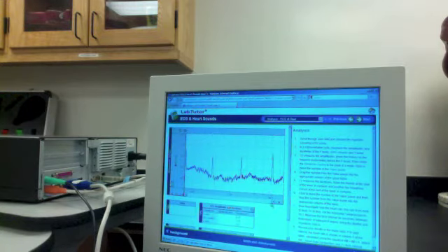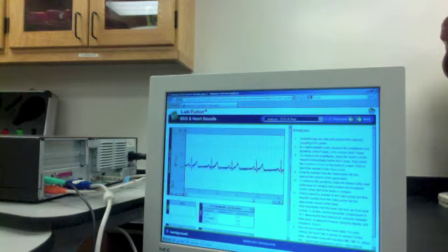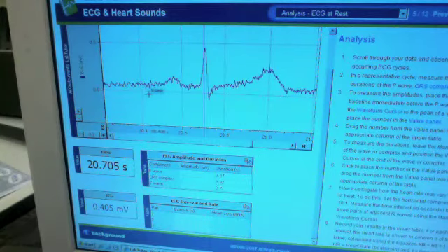And if I scroll through this, if I take this bar and just move it through, I can see all the different stuff that I recorded. I can still change my scales, like so, if I need to, because this is recorded data, and this is just showing you how it's represented differently. This is probably a good little portion here to look at, because it doesn't look like it was too messed up yet.